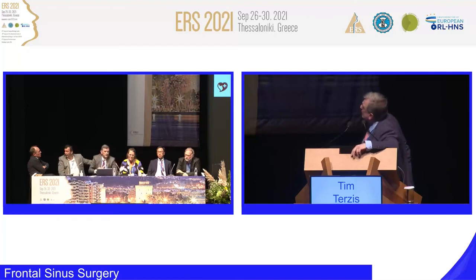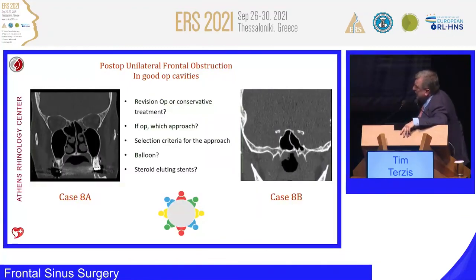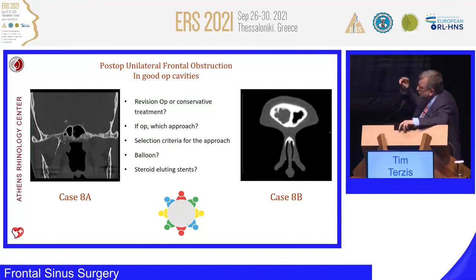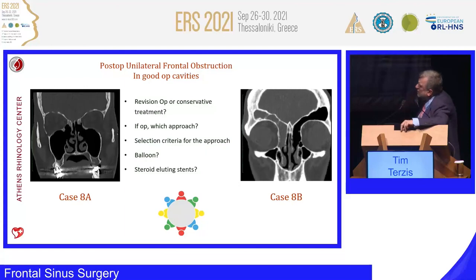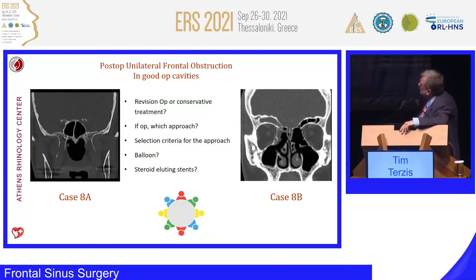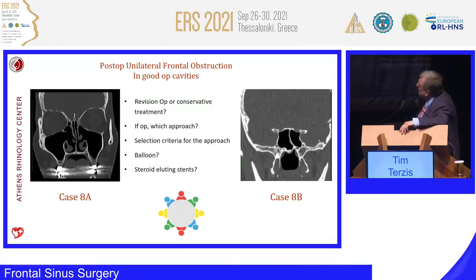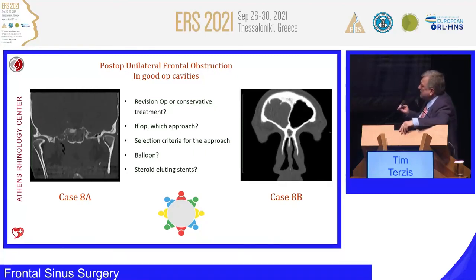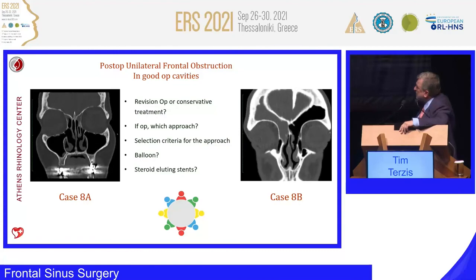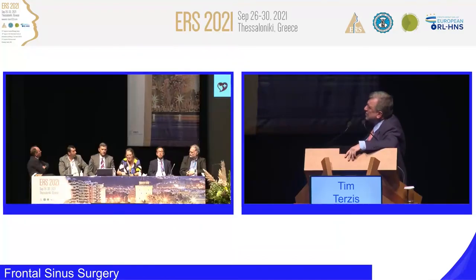On the right side, the gentleman, 8B case, had just polypoid mucosa in the frontal recess, which we topically removed during follow-up, but it kept recurring all the time. So just polyps there for some reason. Wide frontal recess, as you see. On the other, the lady had a narrow recess with neosteogenesis, as you said, Andreas. So, Wytske, what do you think?